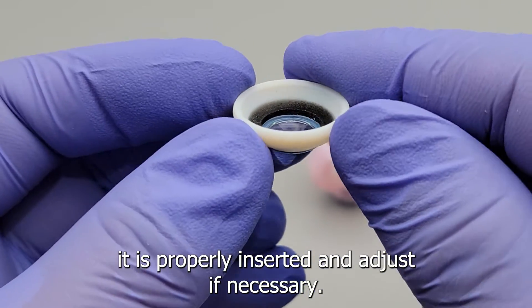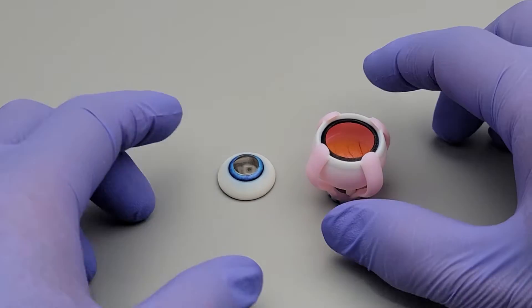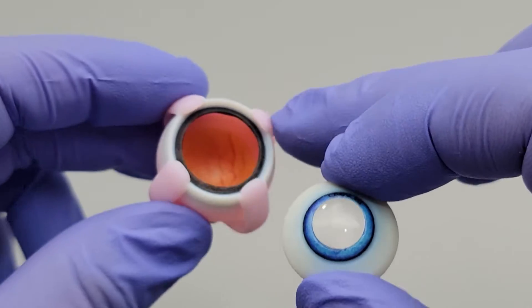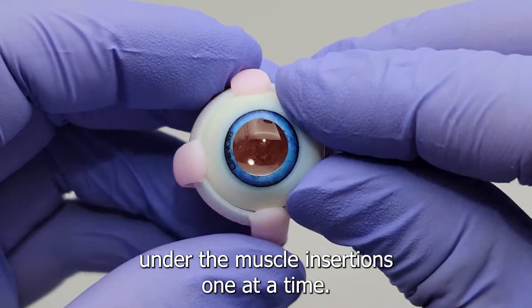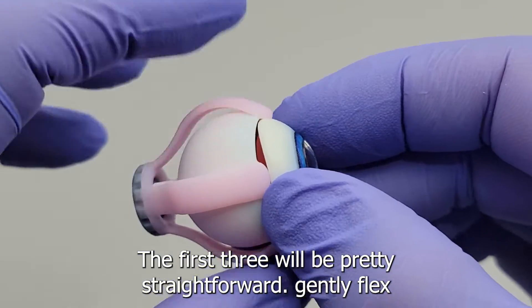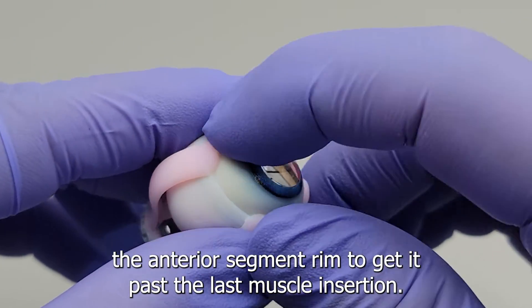Adjust if necessary — the optical element should look nice and even. The last step is to assemble the anterior and posterior segments. Insert the rim of the anterior segment under the muscle insertions one at a time. The first three will be pretty straightforward; gently flex the anterior segment rim to get it past the last muscle insertion.